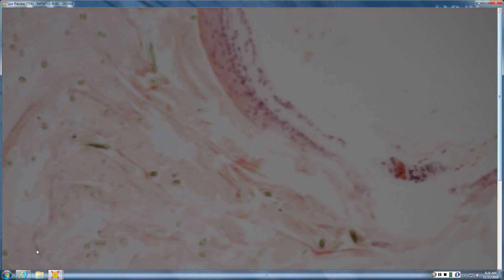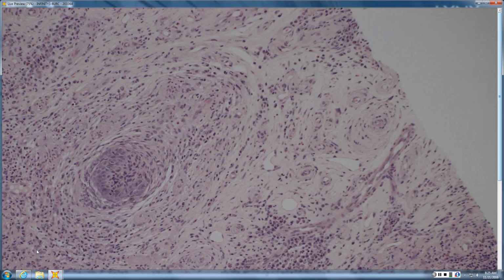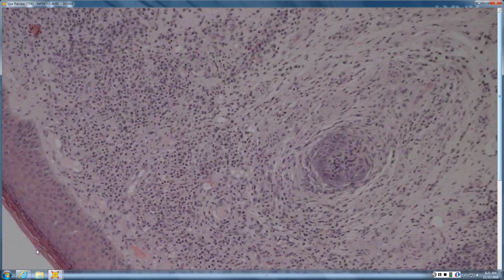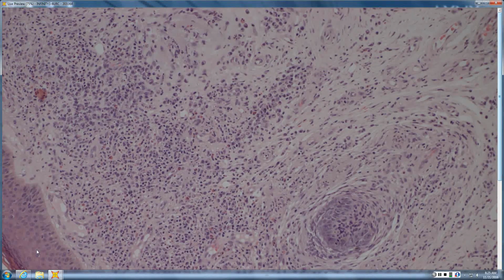See the vellus hair cyst, eruptive vellus hair cyst. I thought this was granuloma faciale. Where's the granuloma? In the name, not in the tissue. So it is a chronic leukocytoclastic vasculitis with eosinophils and typically a Grenz zone on facial skin. So that's granuloma faciale.